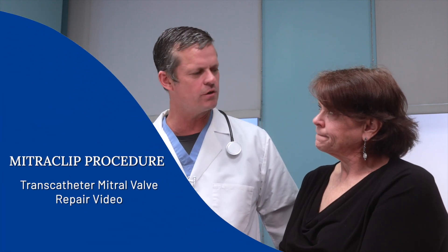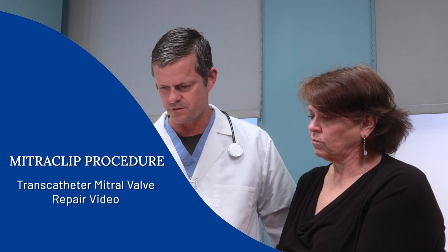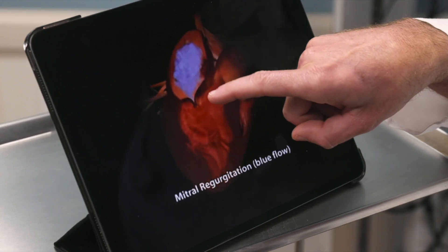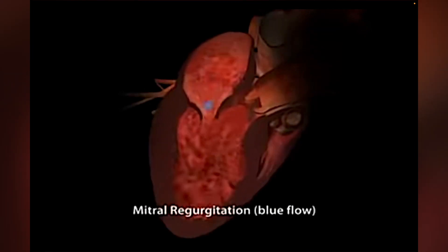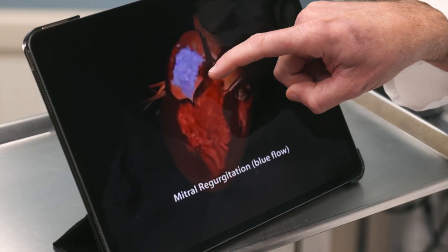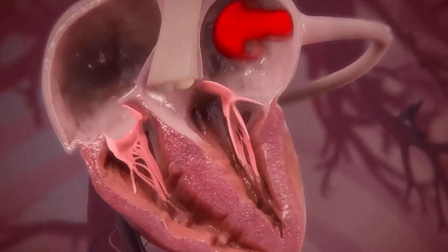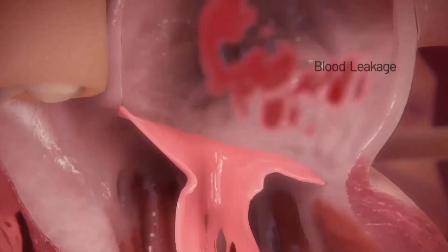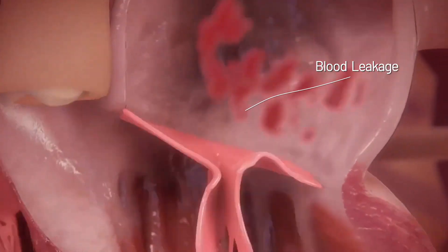One of the first things I like to do is show an animation, which I think is really helpful for patients understanding this procedure. The first image here shows the blood leaking backwards. When the heart squeezes, all the blood should go forward out the aortic valve, and then the mitral valve is here to stop the blood from going backwards. In your case, you have a lot of leakage — sometimes upwards of 50% of the blood is going the wrong direction every time the heart tries to pump.